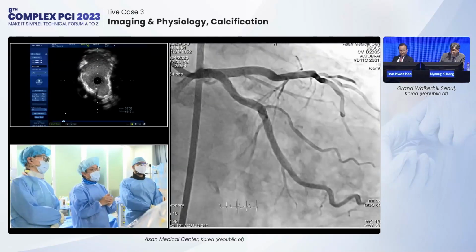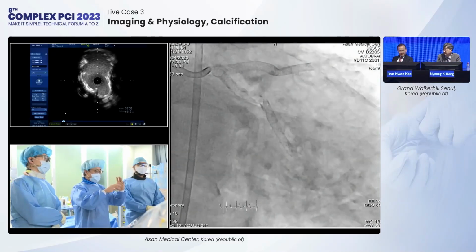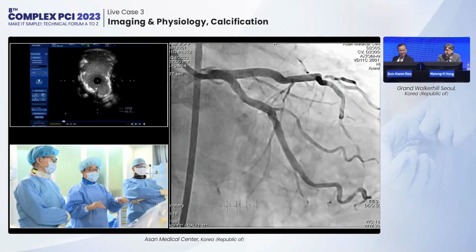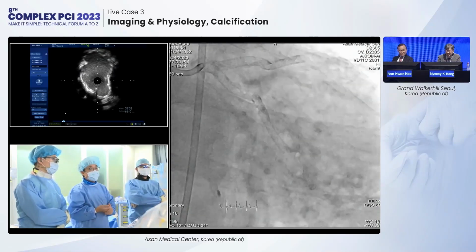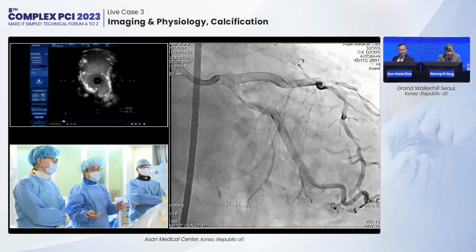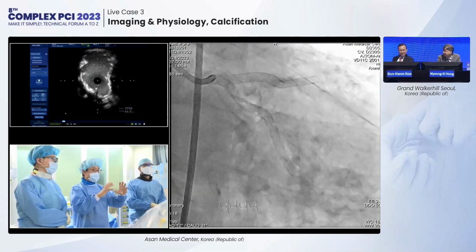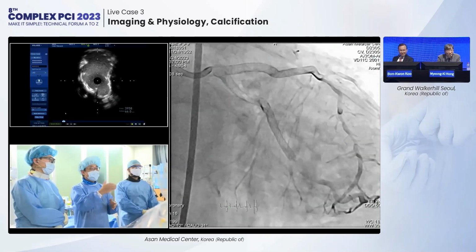But we don't have enough data about whether concentric configuration and eccentric configuration make some difference in outcome. However, on the basis of our larger cumulative experience, we don't do POT and re-POT. Its overall outcome was excellent. So it depends on personal experience and personal expertise. If you have some confidence in your procedure, we can omit this part, the re-POT. And the lumen was expanded well, and the minimal stent size is enough. That is a guarantee of a favorable long-term outcome.